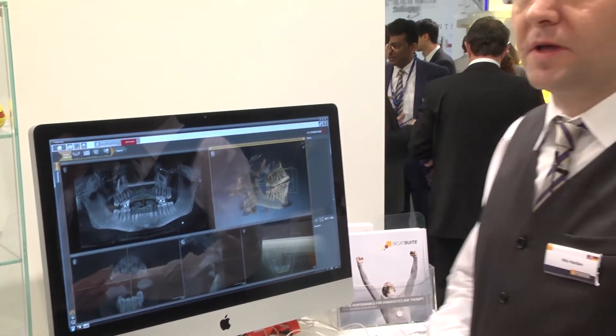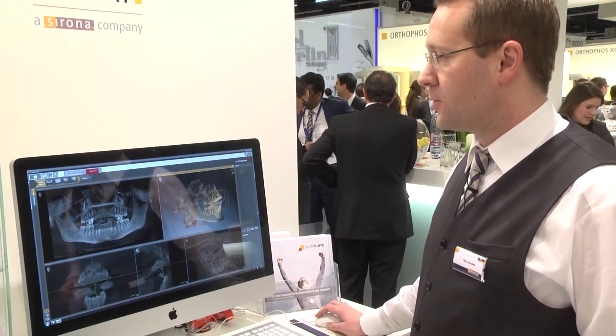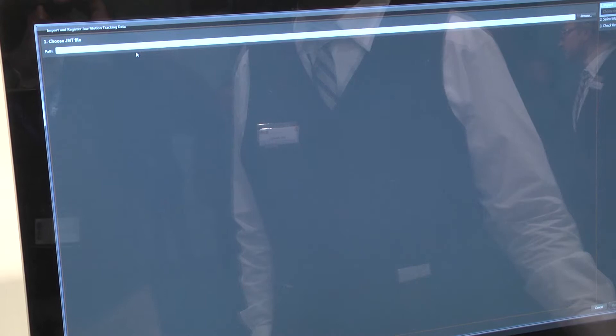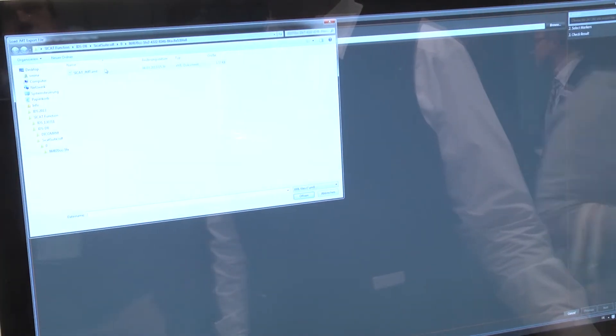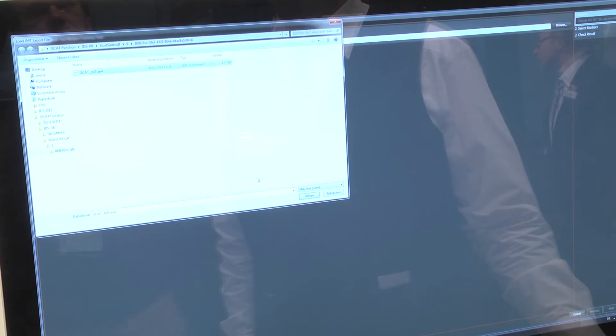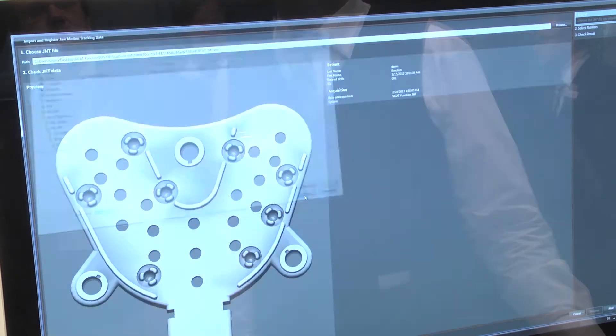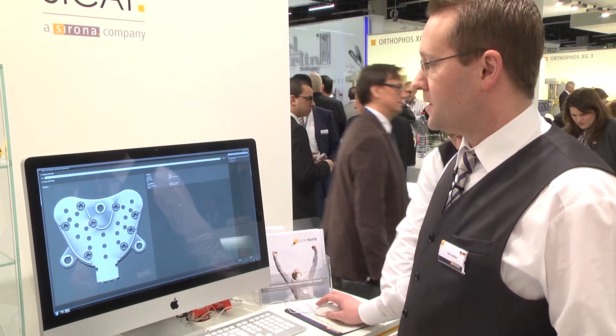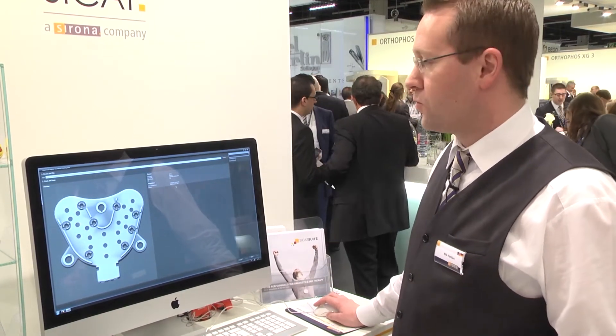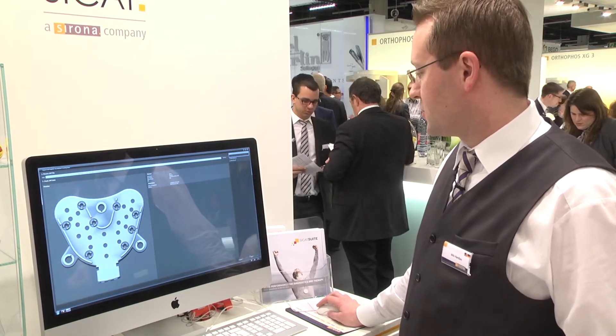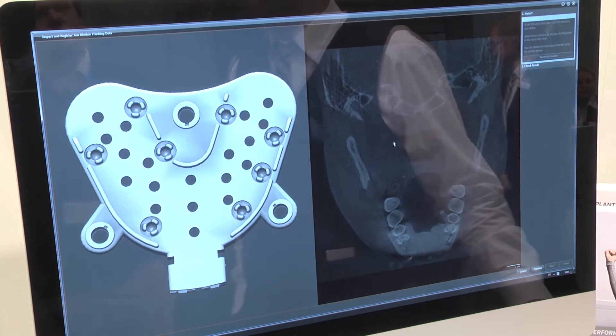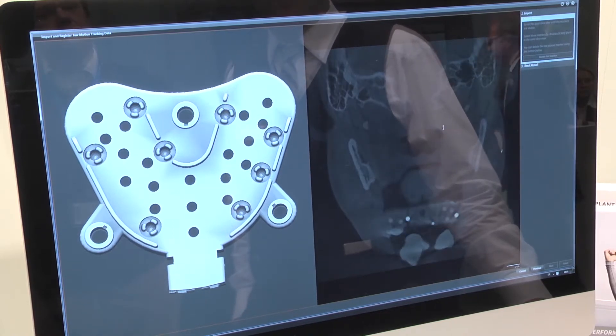What I do now is to import patient-specific jaw motion data we acquired with the SICAT Function JMT device. For that I will click this button here above in the toolbar. I quickly select the motion data, and here you see the reference spoon we use for bringing the data together, the patient-specific movement data and the DVT data or CBCT data. Here is some information about the patient and when the data has been acquired, and I quickly go to the wizard to show you how we register the motion data and the CBCT data together.